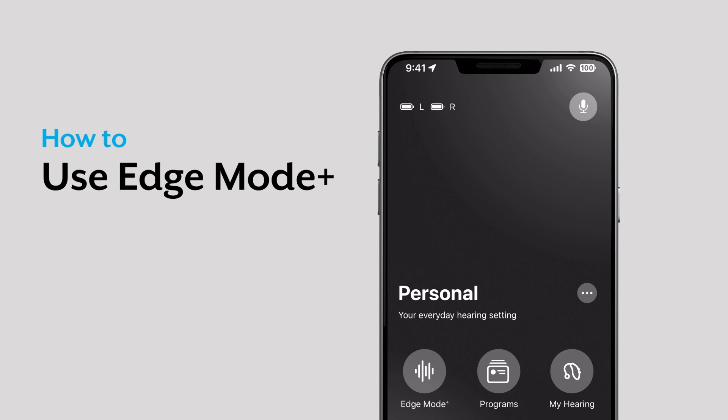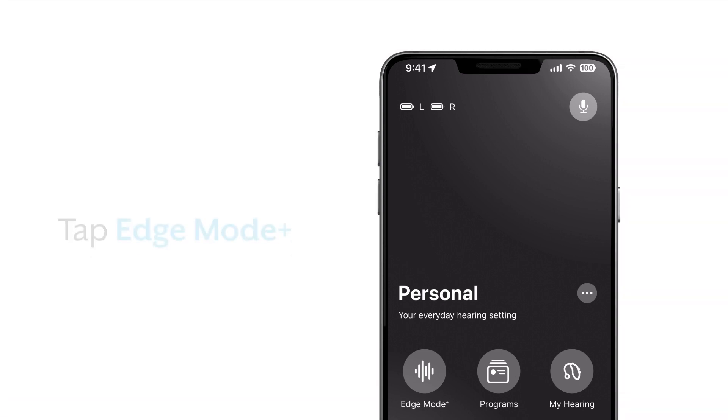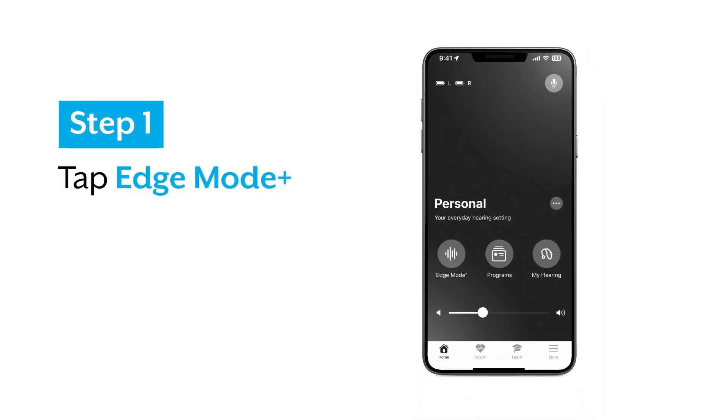The Edge Mode Plus feature on your hearing aid app can help instantly. Just tap the Edge Mode Plus icon on your home screen.